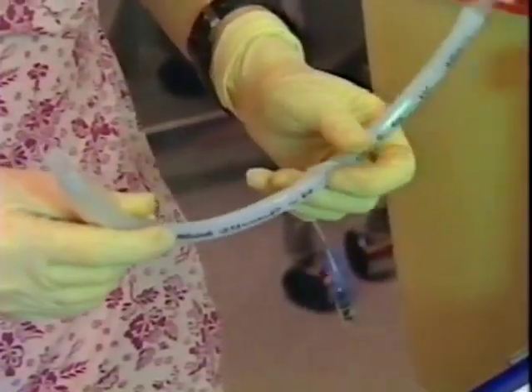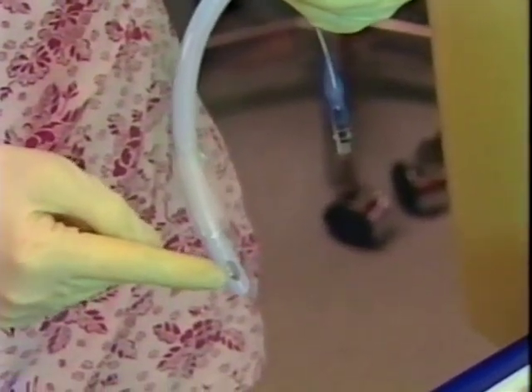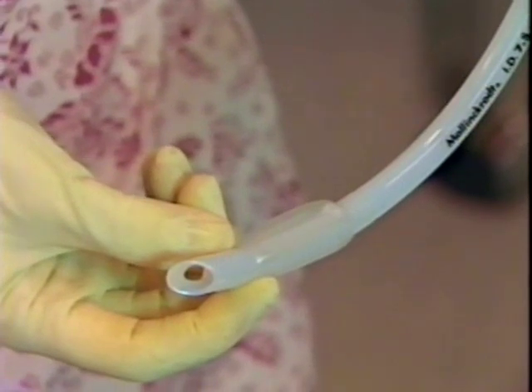The endotracheal tube has 2 openings on the patient end. The side opening, called a Murphy eye, prevents obstruction when the tip of the endotracheal tube is up against the tracheal wall. The beveled tip serves the same purpose when the tube tip is against the carina.